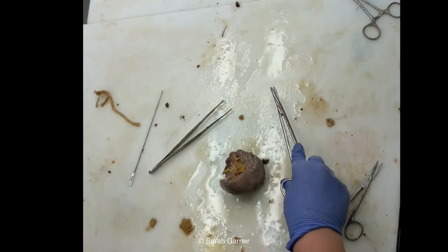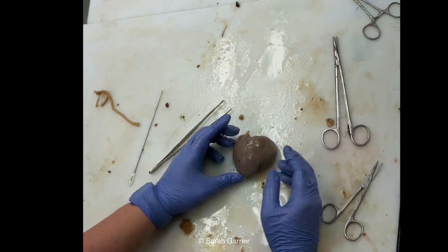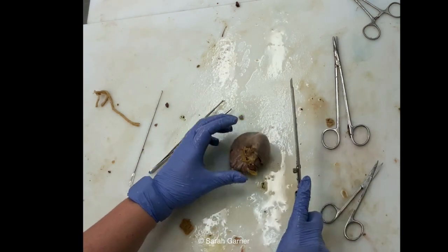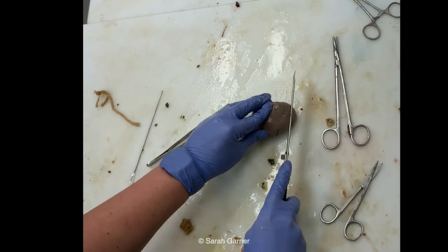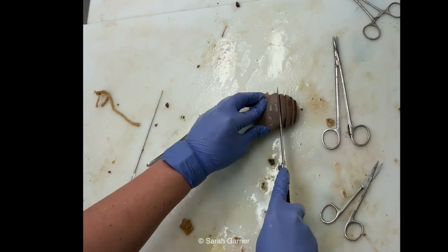So you should have trimmed off all that fat and whatnot before you weigh it. And then you're just going to section it. So you would note anything abnormal on the outside, if there is anything abnormal, and then basically just bread loaf this one as well.